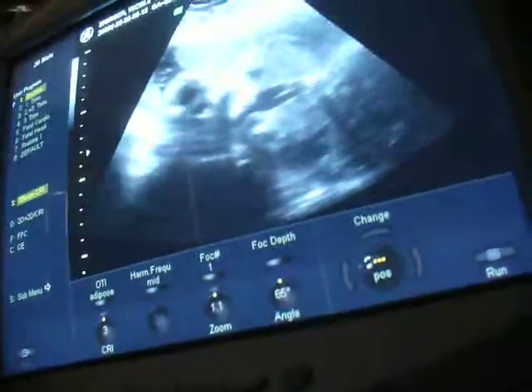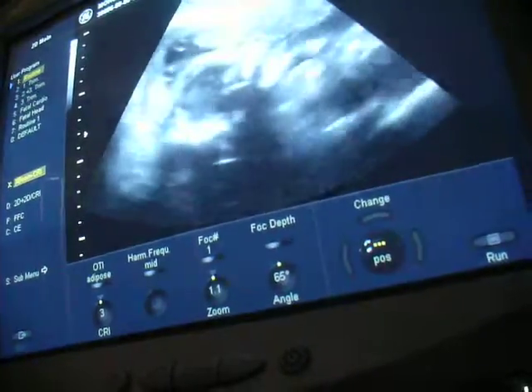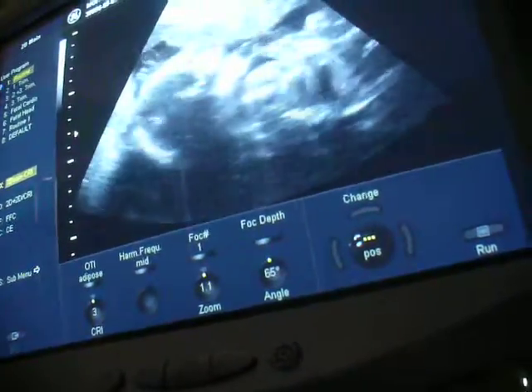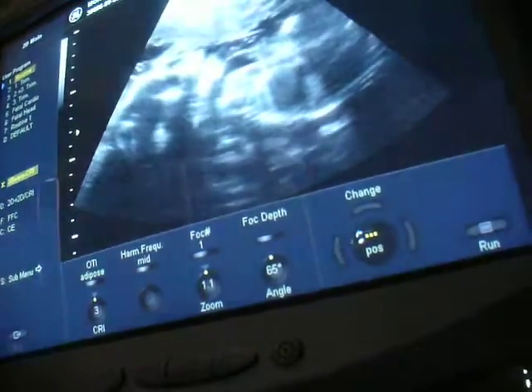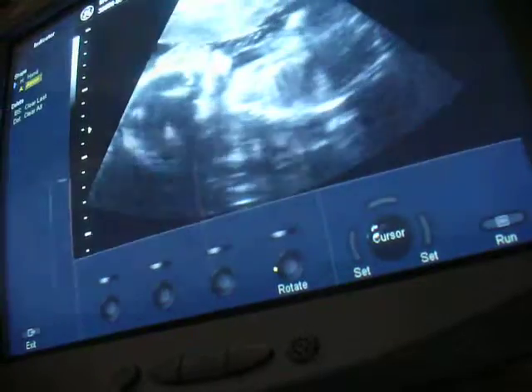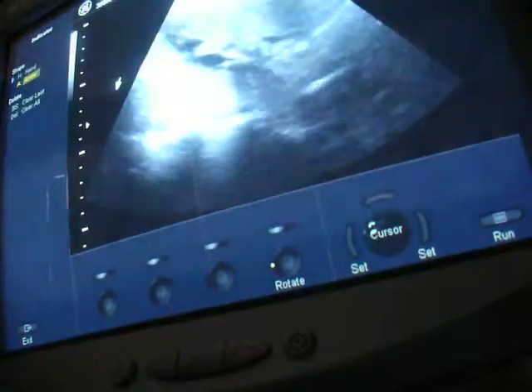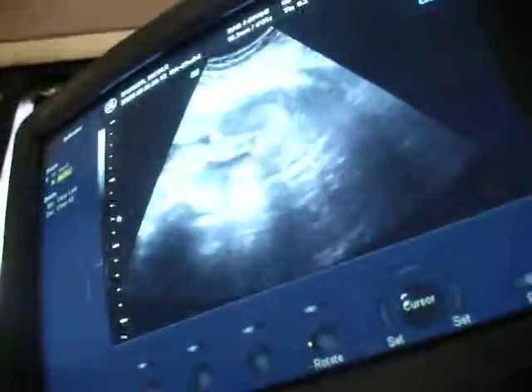The girl. There's a little face right there. Yeah, but so far, I'm looking pretty good. You can see a little mouth right here, a little bit of the nose, got that foot all the way up in front of its face here. There's the little bottom of the foot.